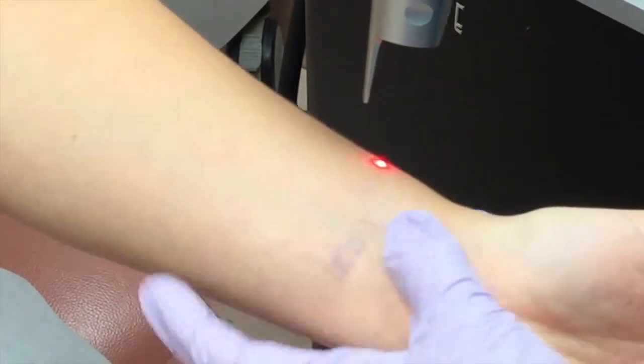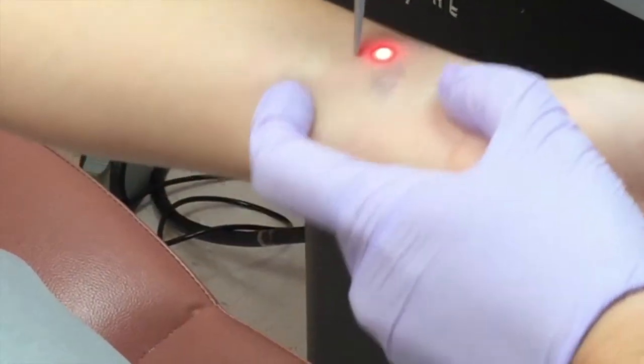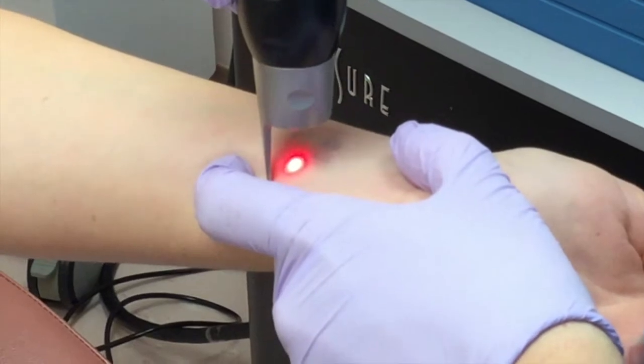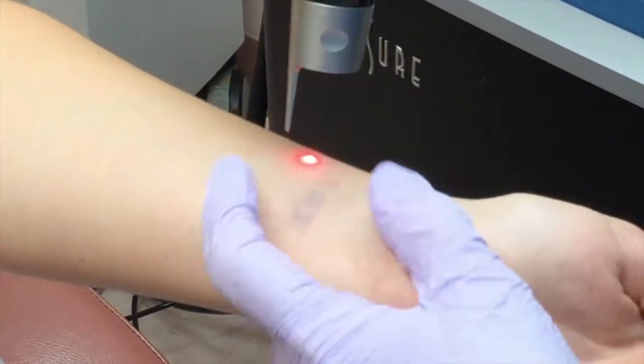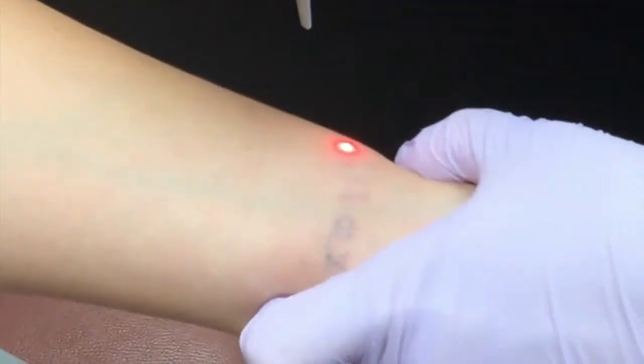So I want to make sure, because you know the image better than anyone — you wanted me to get the little dots. Yes, please. I remember you mentioning that. And how about the pain at this point? No pain at all. Okay.